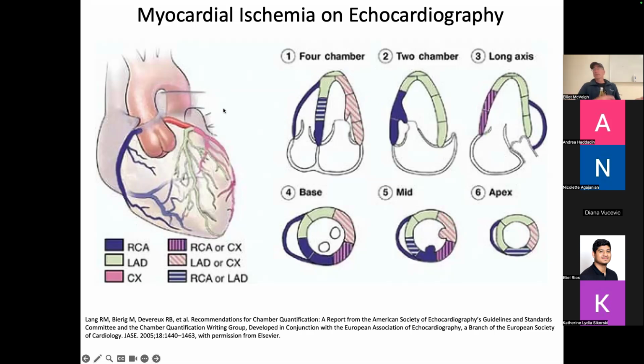But when you come to the hospital and you have crushing pain and your ECG is screwed up, then for sure you get the stents out, you get ready to open up a lesion. And what can happen is you can go straight to the cath lab and they take a picture and look at it. Or if you're not in super distress and your ECG is still normal, they can take you to have an echo and they'll look at how the heart is contracting.